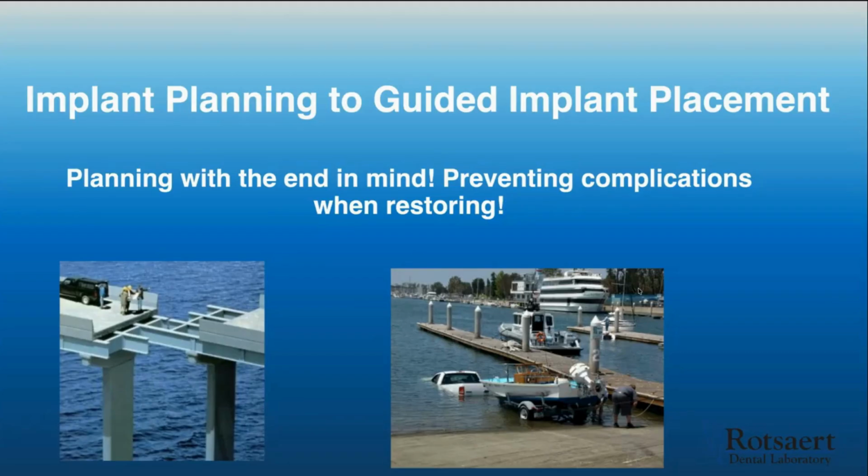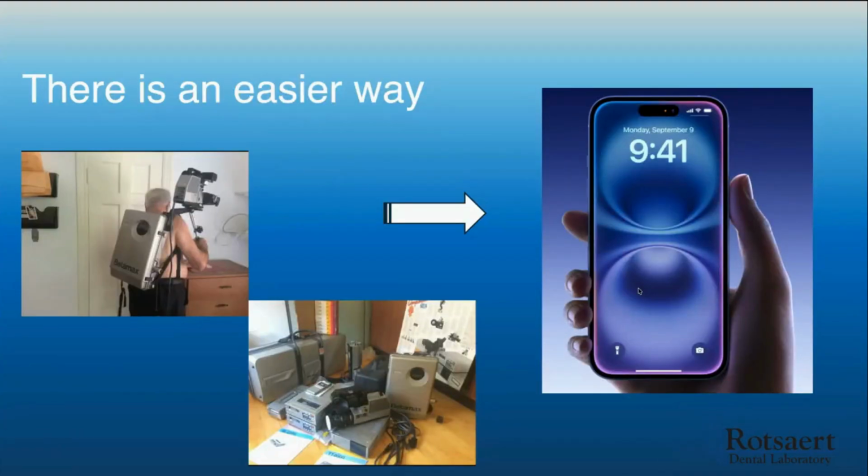The company specific instructions are the first go-to for you when it comes to step by step. And even from a laboratory perspective, they keep us up to date, but we're never up to the minute when it comes to these different solutions. I've used this slide before, but it's one that I always find interesting. If you look on the left, it's essentially everything that now is packaged in our phones on the right, plus. That was just a video camera system in the early days. So obviously things are getting more efficient and a little more predictable for all of us. And of course, adding a lot more complication in some ways, or distraction.